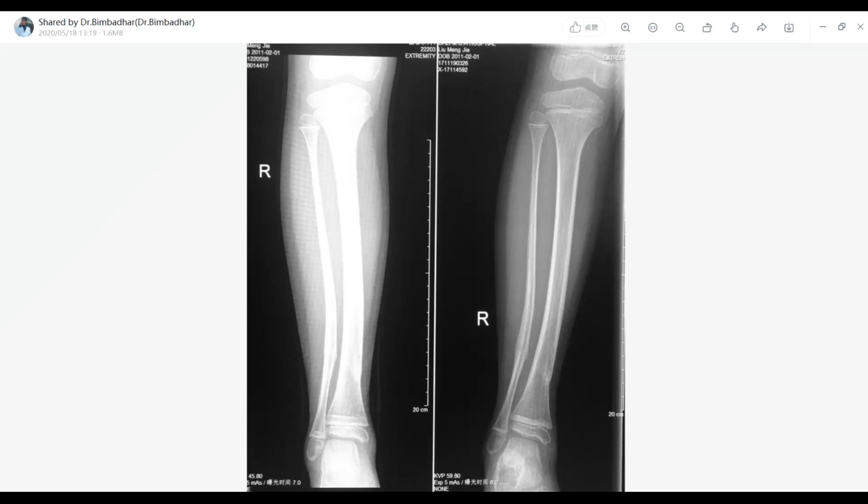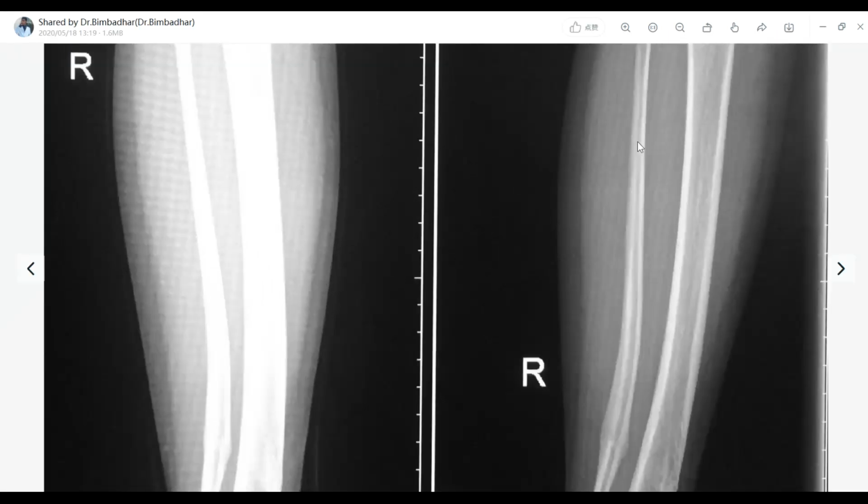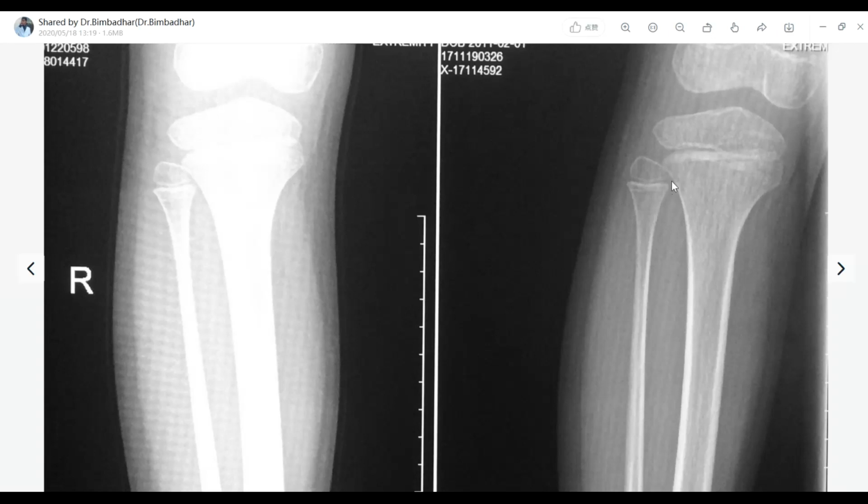Can everybody see the screen? That's what I'm saying. You see here, that's the confusion part. Exactly, Devendra, I know most of the people would talk about this one. I said always compare to the symmetry. Yes or no? So when you are comparing to the symmetry of the bones, now try to look at all the bones that are present down here.